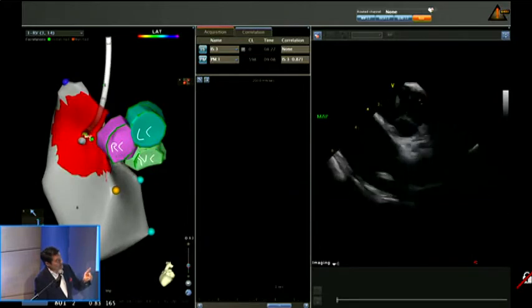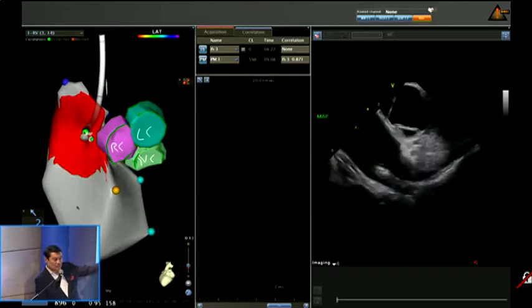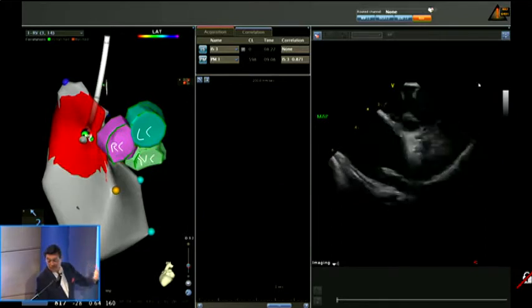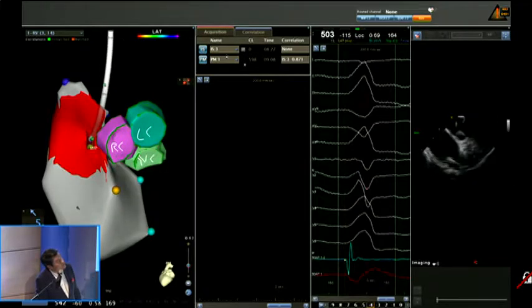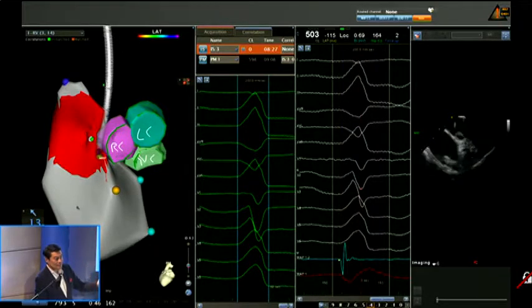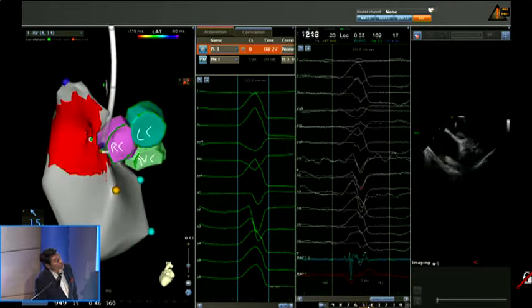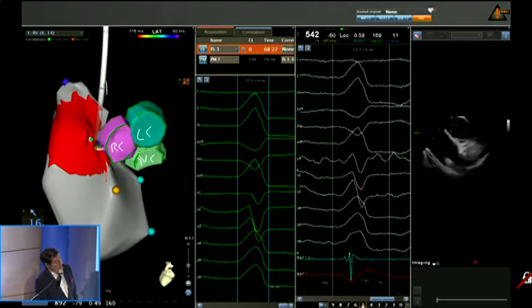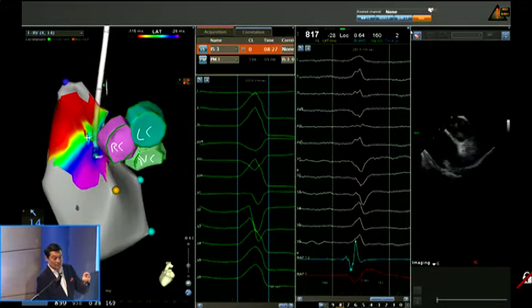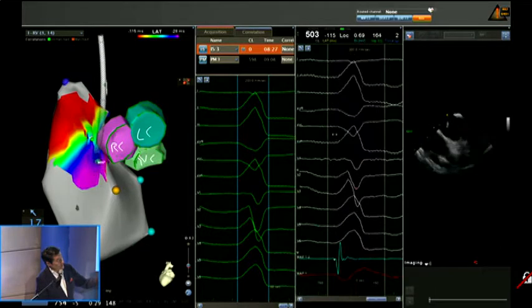If you see the slides from Pennsylvania University, they always put the sign to the left. You will see the images just the other way around. Most labs put it on this side. So whenever you read a paper or images from presenters, please keep that in mind. Remember that in this way of seeing things, you can recognize the structures that help remind you which cusp you are in, because that's fundamental.